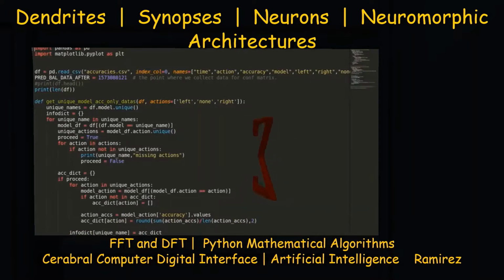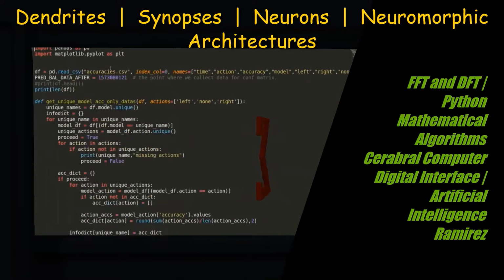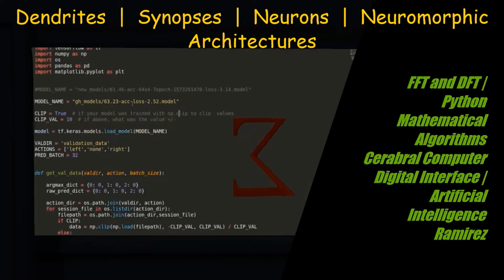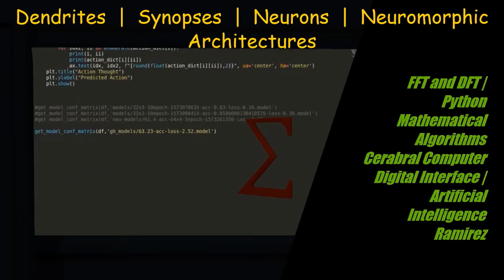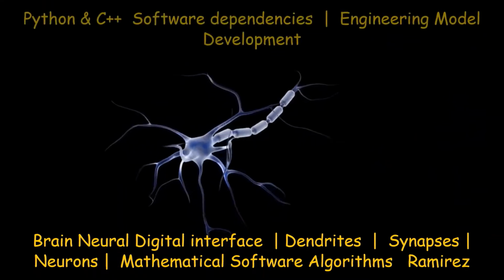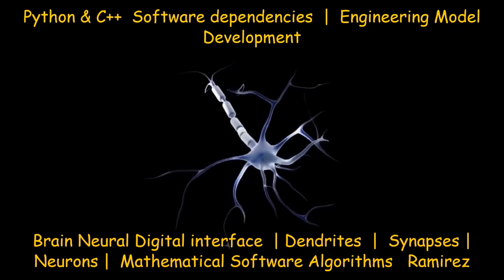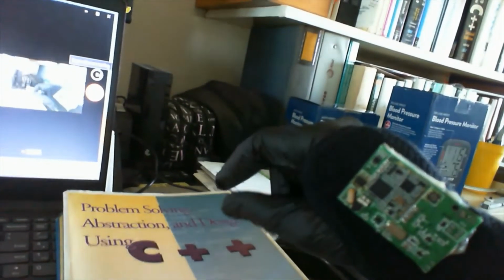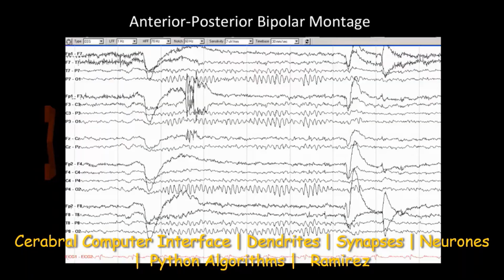Classifiers are able to learn how to identify the class of a feature vector. This is possible via the training sets, labeled feature vectors extracted from the training EEG examples.